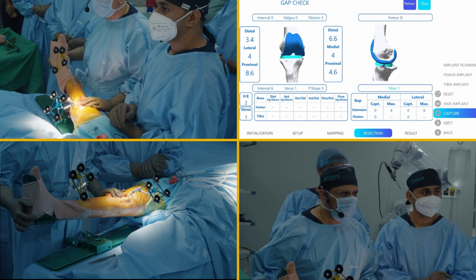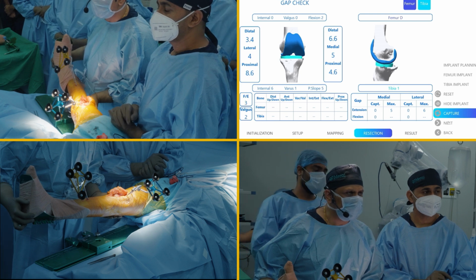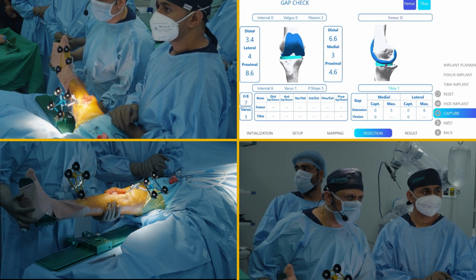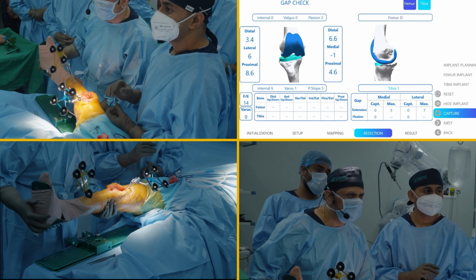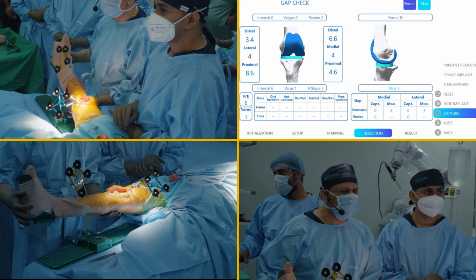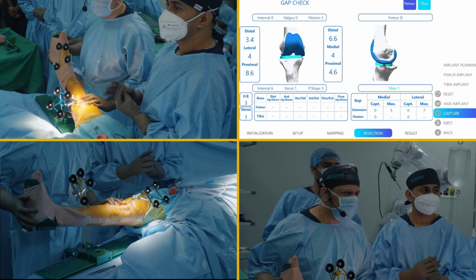Now I am trying to give the valgus stress and seeing the medial side. If you see on the screen, it's opening 5, lateral side is 4. If I leave it without stress, it is 4 and 3. If I give a varus stress, it is 6 and -1. That means it's opening more on the lateral side when I give a varus stress, and on a valgus stress it's opening very minimal on the medial side. Now the deformity is 2 to 3 degree sagittal deformity, varus is 0 to 1 degree.